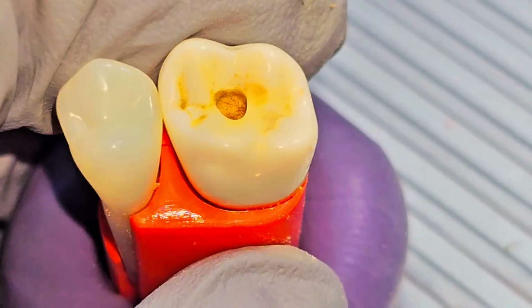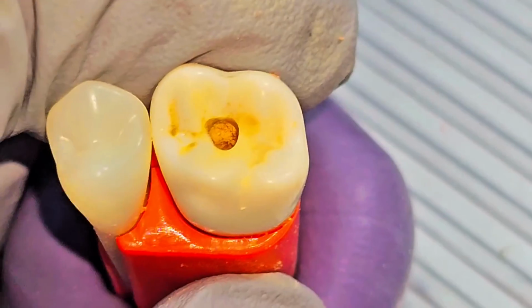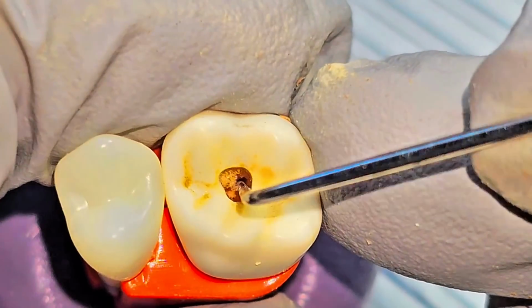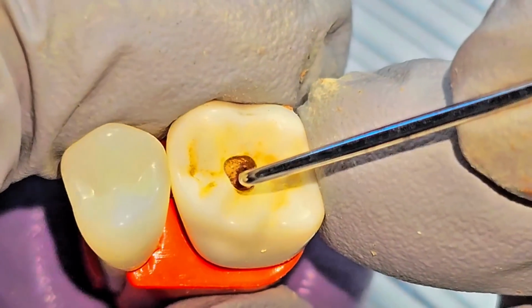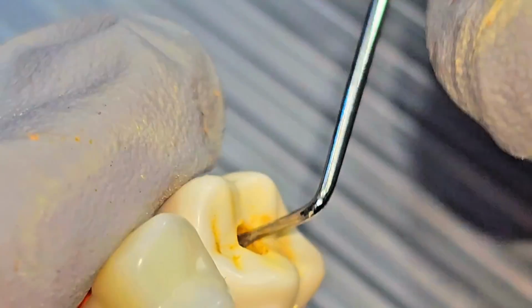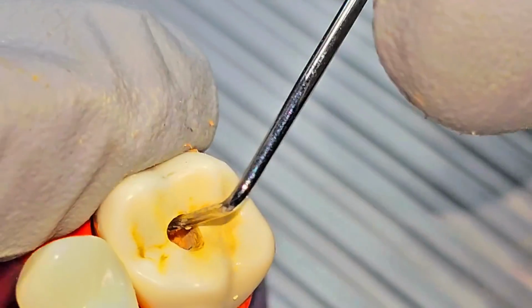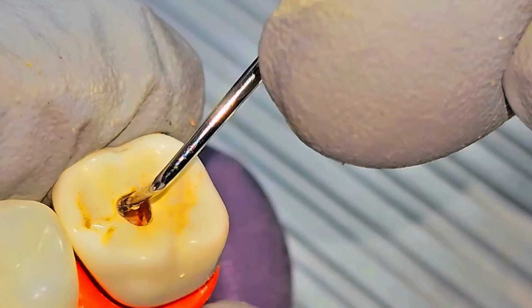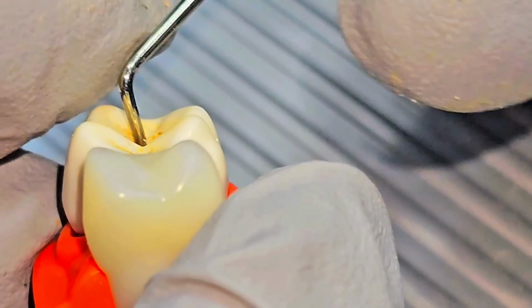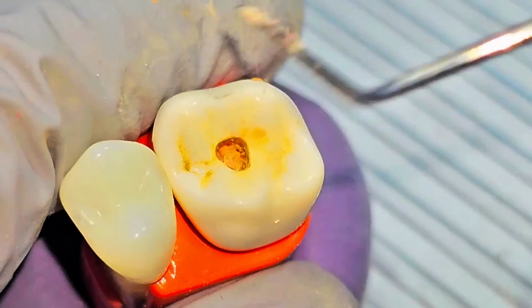Now I'm going to use the explorer. This is the endo explorer. Now I feel the canal here. Do you see the angulation? If you see the angulation, it is too much bent, then it is not a straight access prep, so I'm going to dig into this area a little bit more. And also here, it is leaning too much. I cannot put it straight, so I'm going to make the access prep straighter there.